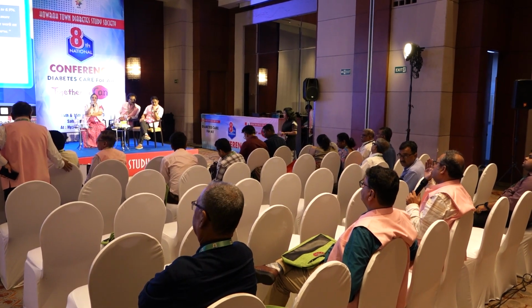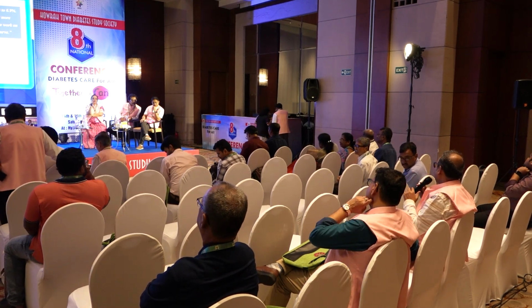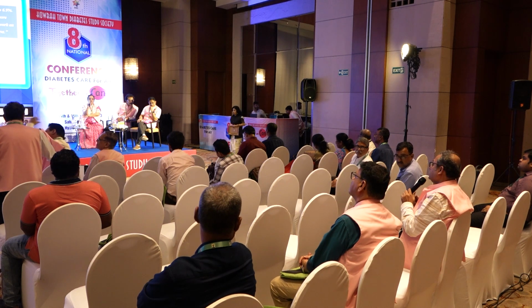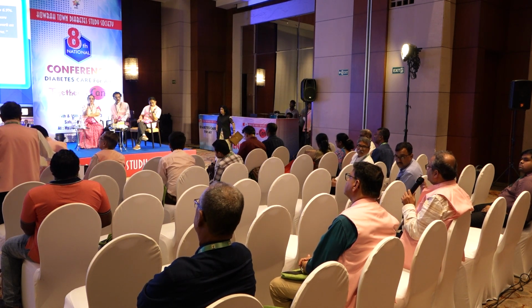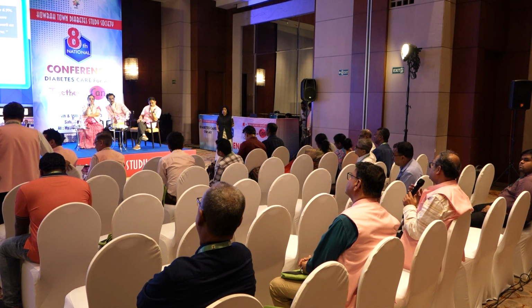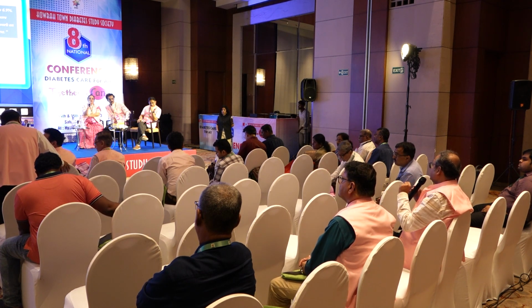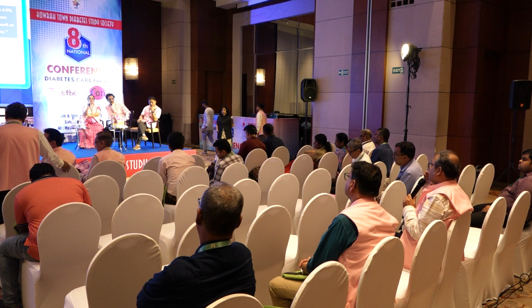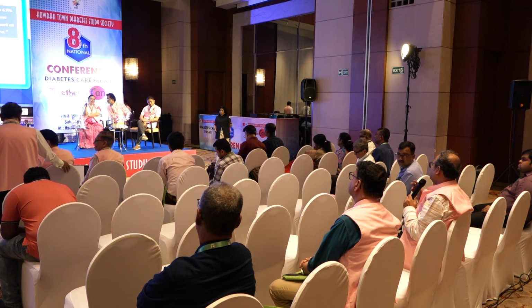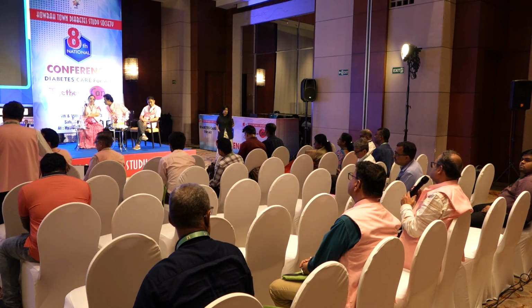Say blood sugar is 300, 350 and he is used to it; when it comes down to 160 or 180, they feel hypoglycemic symptoms. In this class of patients, I use AGP, this Freestyle LibrePro, to ascertain whether it is real hypoglycemia or the sudden fall in blood sugar causing these symptoms. Apart from this, one thing is very important with this Freestyle LibrePro: nighttime hypoglycemia at 1 a.m., 2 a.m., we can never diagnose with a run-of-the-mill glucometer. So in these two particular patients, apart from what you said, this device is very, very useful.